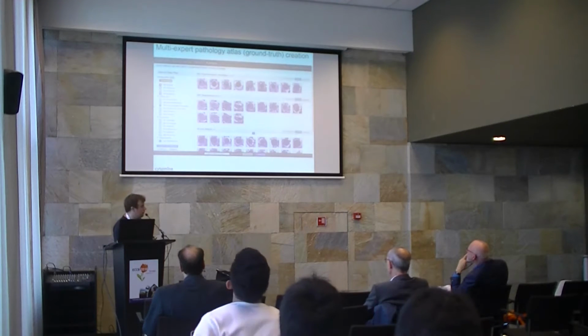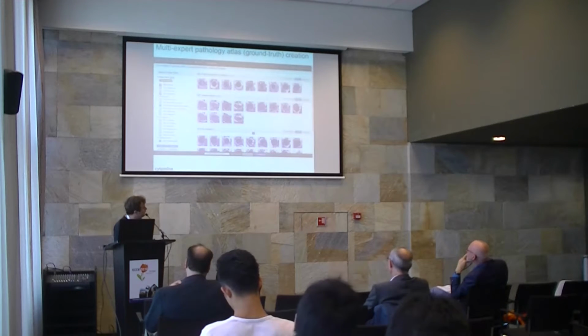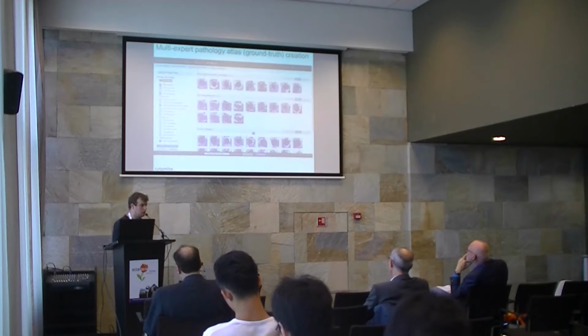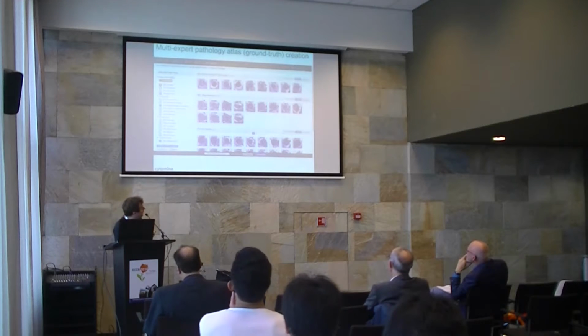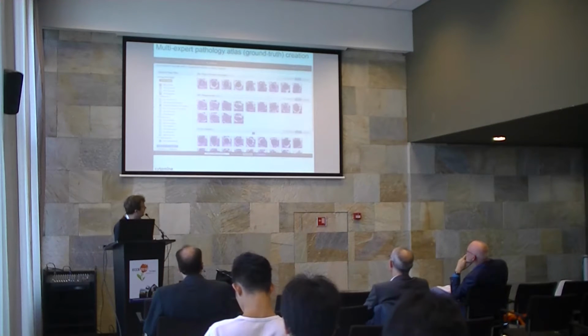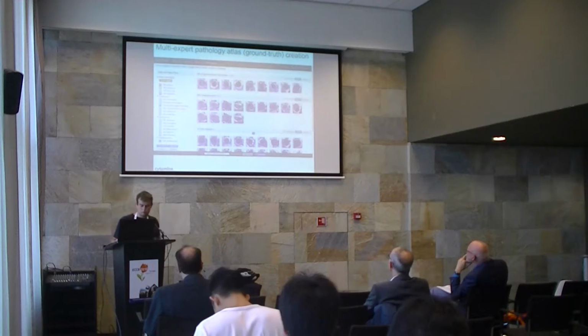And so what people can do with this is to annotate large sets of images and build ground truth data for people working in machine learning. So for example, here you have different types of cells, bone marrow cells, that have been annotated by some experts, and you can easily visualize galleries of this annotation and easily export this annotation for machine learning.